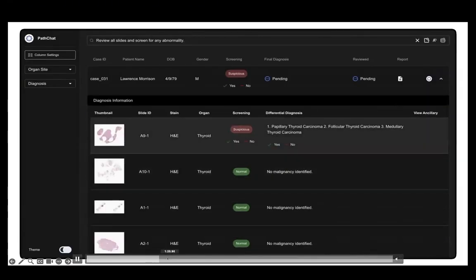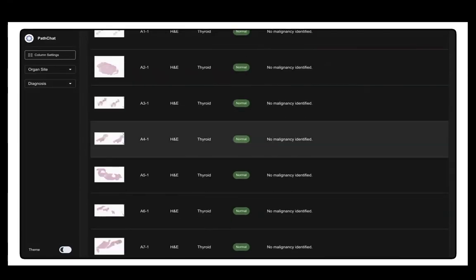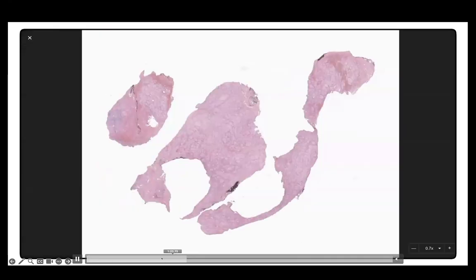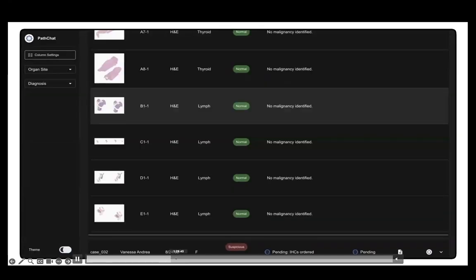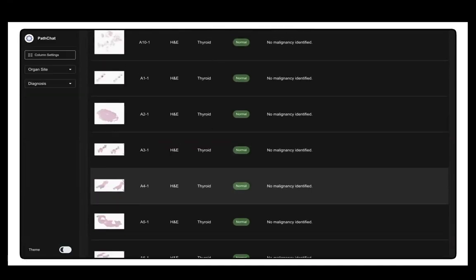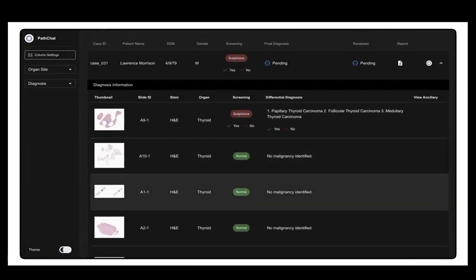And this works pretty universally across infectious, inflammatory, and neoplastic disease. So it's not limited to cancer. Something you effectively need if you want to have a real triage tool. Then the other capability is that because it's a generative model, you can look at a case and say which additional tests need to be ordered to diagnose a case, and it will order those tests on its own.